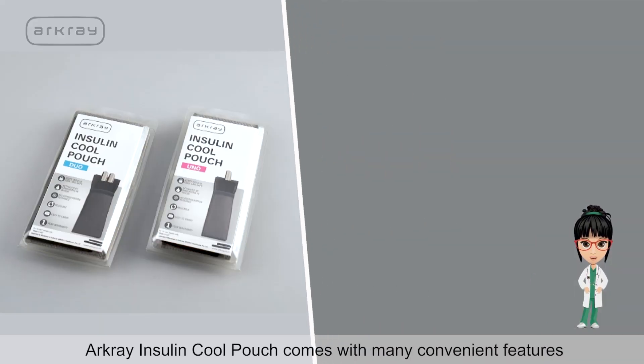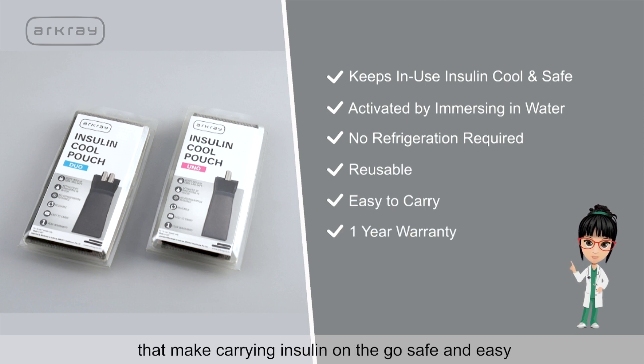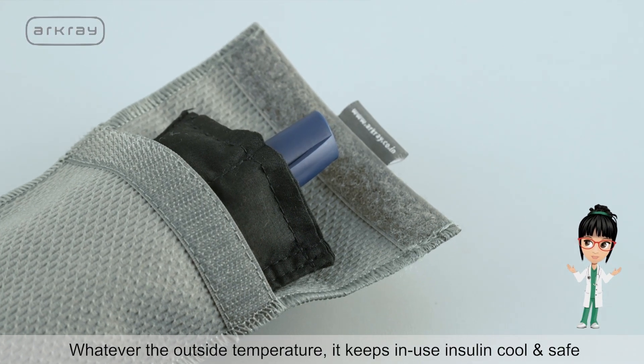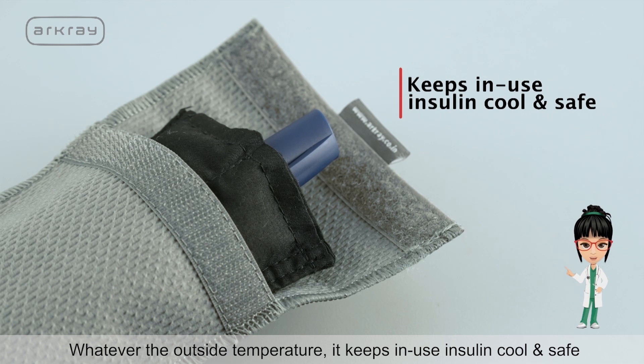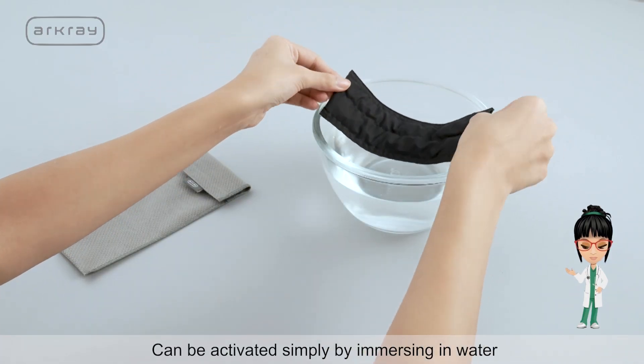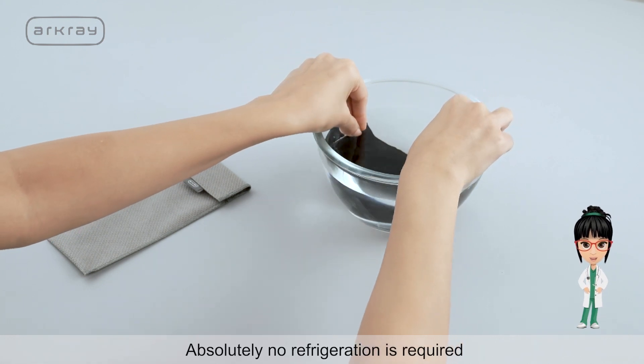Arkray Insulin Cool Pouch comes with many convenient features that make carrying insulin on-the-go safe and easy. Whatever the outside temperature, it keeps in-use insulin cool and safe. It can be activated simply by immersing in water. Absolutely no refrigeration is required.